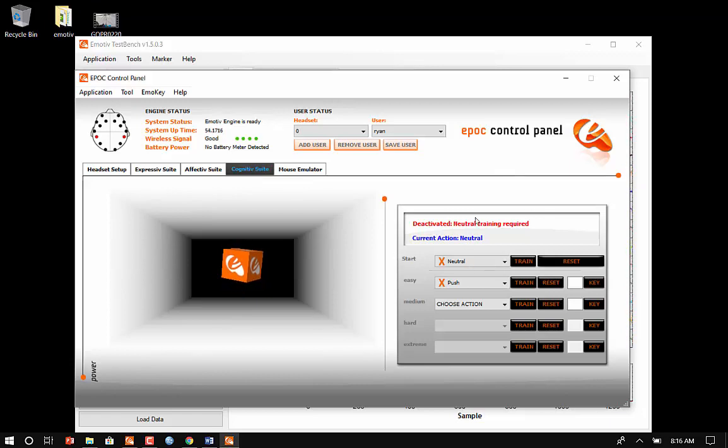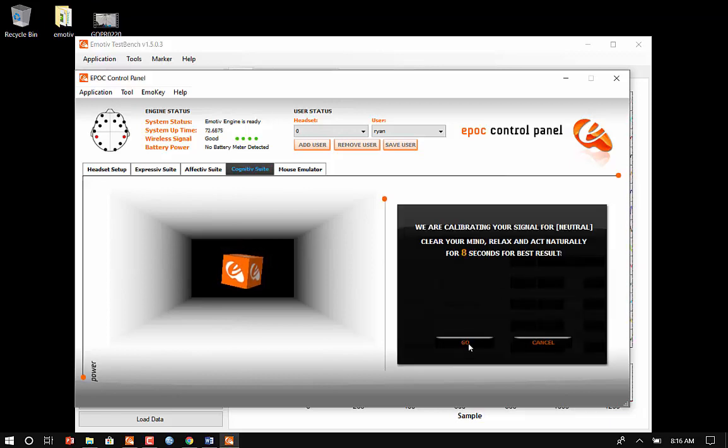Okay. So what we're going to do is he can't see what's going on the screen. So we're going to teach his brain to do something. He's not going to do anything, but he has to think about something to do it. So I want you to close your eyes and just think of a nice relaxed scene. Just think of nothing. Just relax.